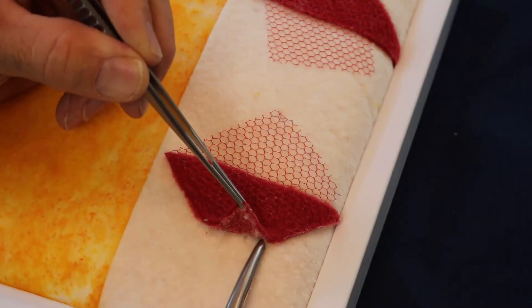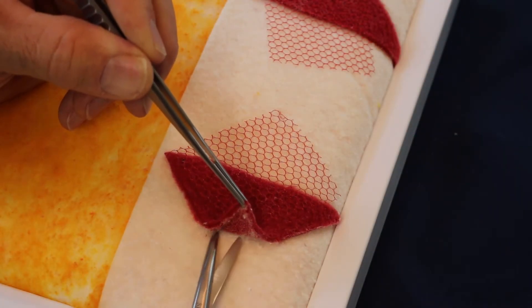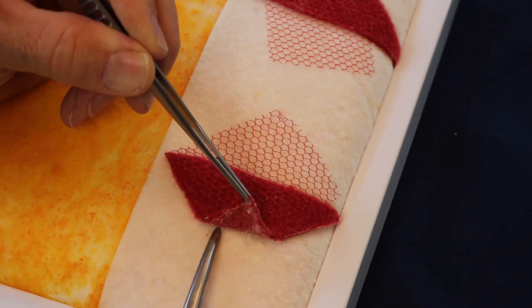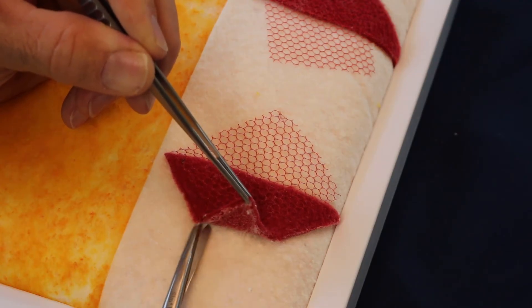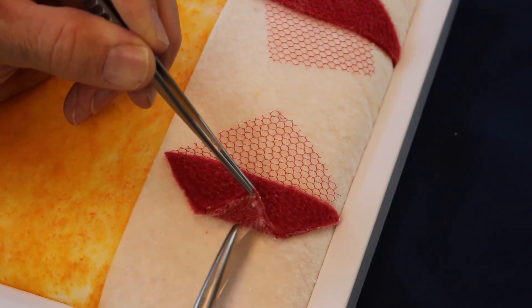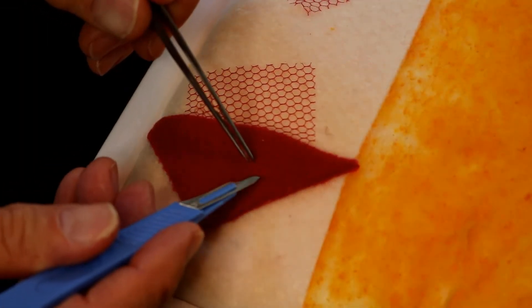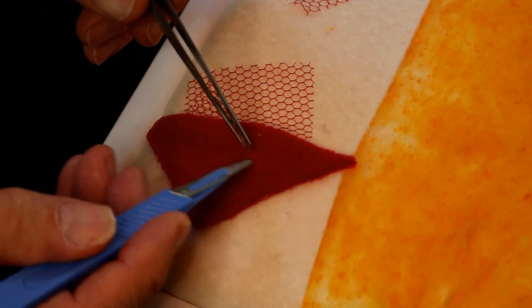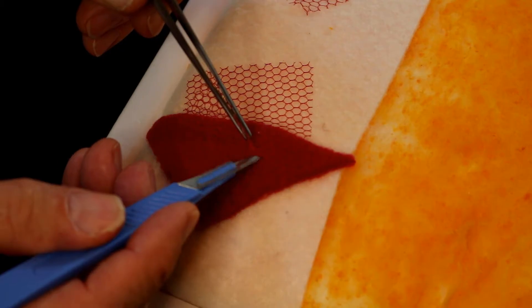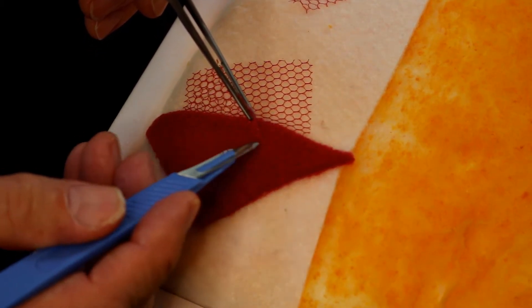One of the important principles of dissection is finding the natural planes between tissues and proceeding in a direction that offers the least resistance and least bleeding. These tissue planes are usually found between tissues of differing densities in their anatomic configurations.